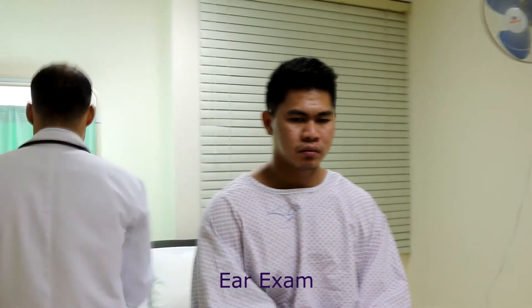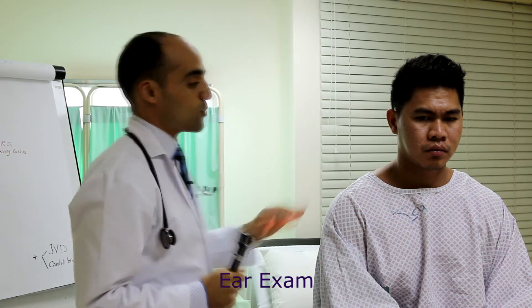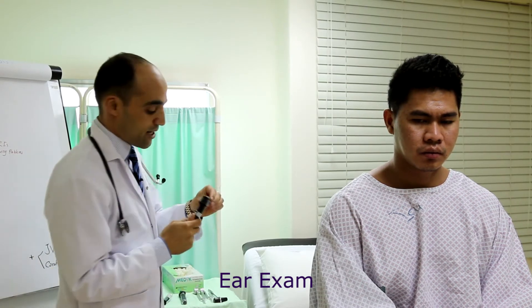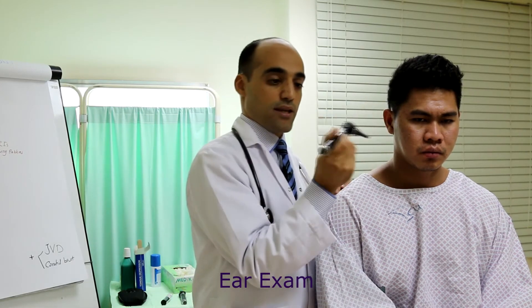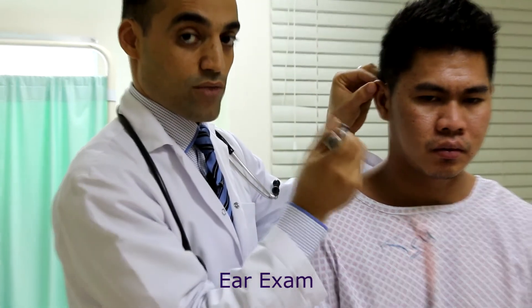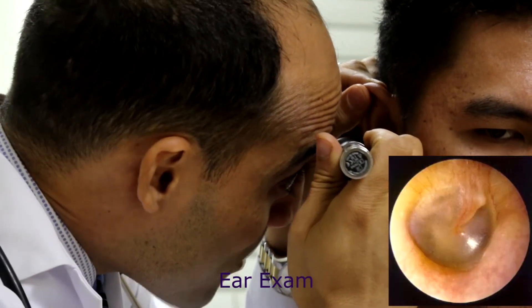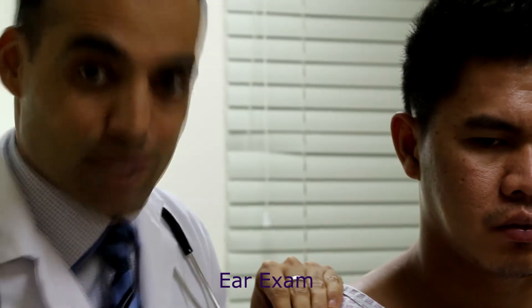Tell the patient that you are going to examine the inside of the ear. I'm going to examine the inside of your ear. Use a disposable towel and a new ear piece. When examining the right ear, hold the otoscope with your right hand and straighten the ear pinna up to straighten the external auditory canal. Look inside the ear — I'm seeing now the tympanic membrane and the light reflex.